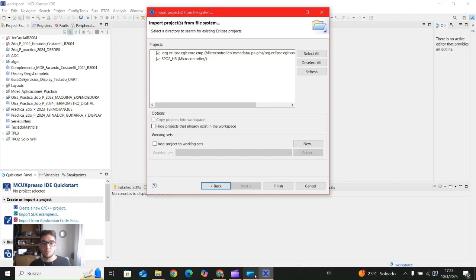So, here, these are the projects that I mentioned before that have this tick box. So we maintain this. Okay, we keep this tick. So we click on finish.